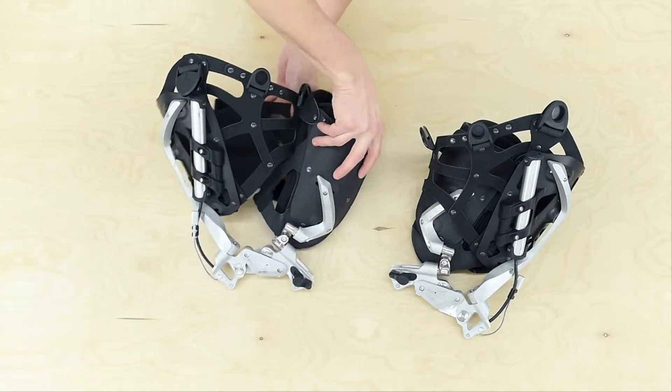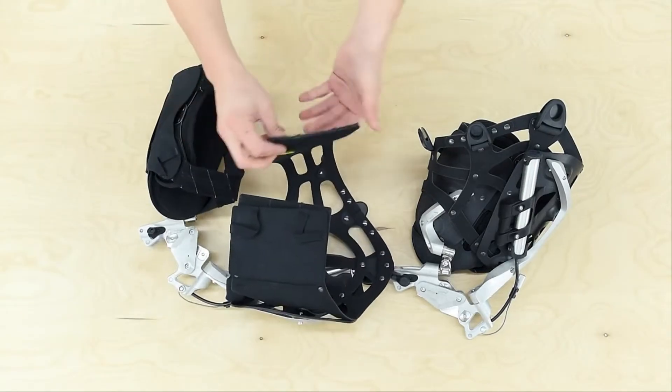Before starting, ensure that both modules in the box match the required sizes by checking the labels on the harness.